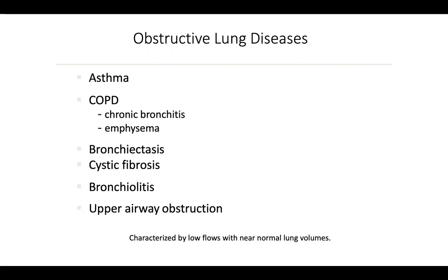Other provocative tests that we can use are the histamine test and methacholine provocative test, wherein incremental doses of histamine or methacholine of 25 mg per ml are given, and the response of FEV1 is seen. Ideally, FEV1 decreases by around 15 to 20% when compared to the baseline, which is suggestive of asthma.